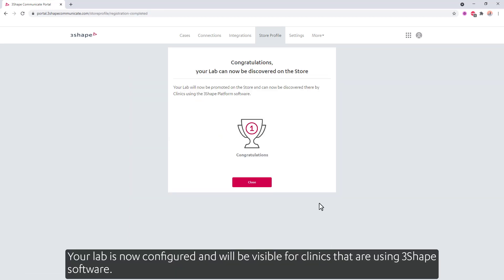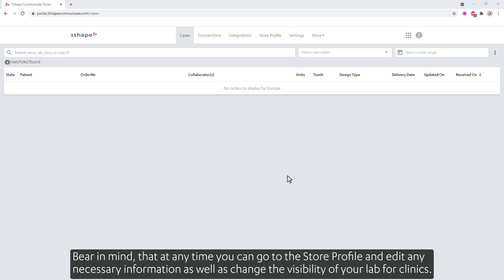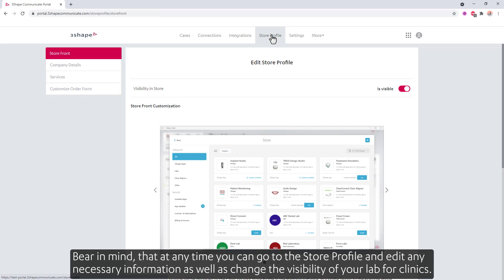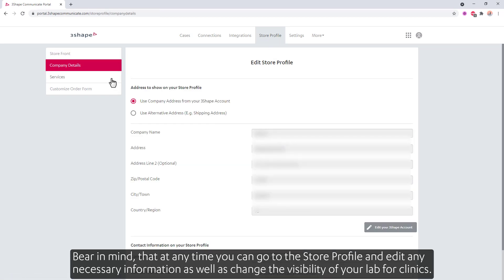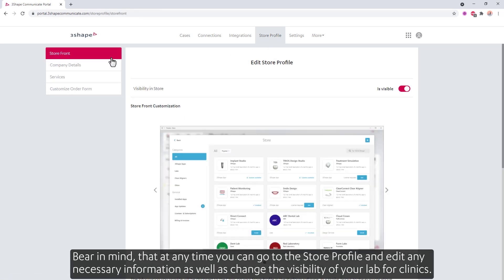When all is set, click Done. Your lab is now configured and will be visible for clinics that are using 3Shape software. Bear in mind that at any time, you can go to the store profile and edit any necessary information, as well as change the visibility of your lab for clinics.